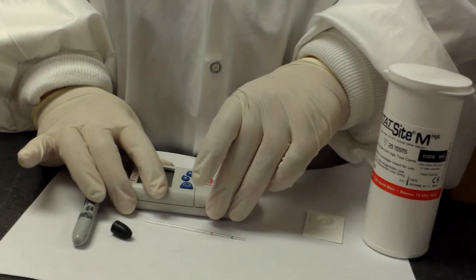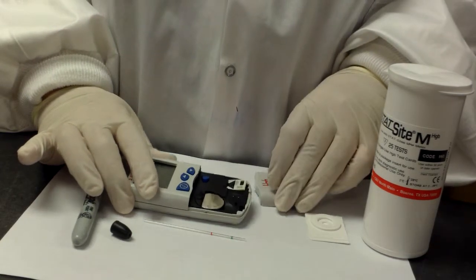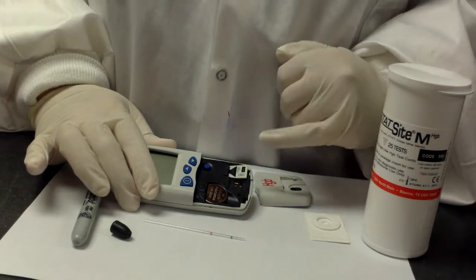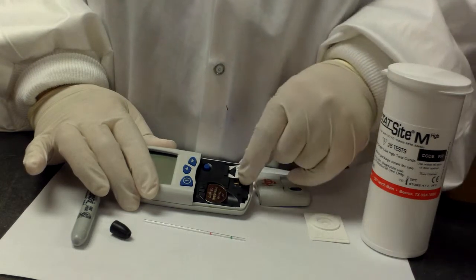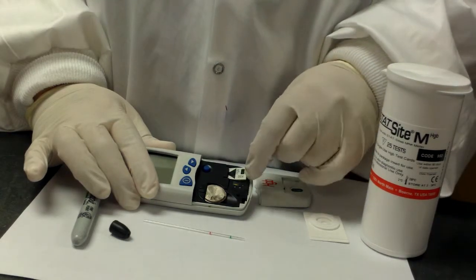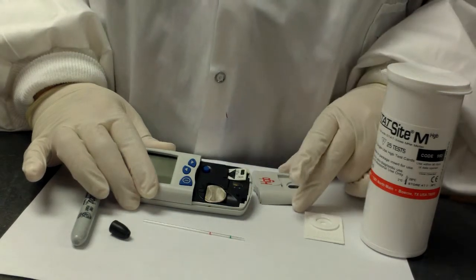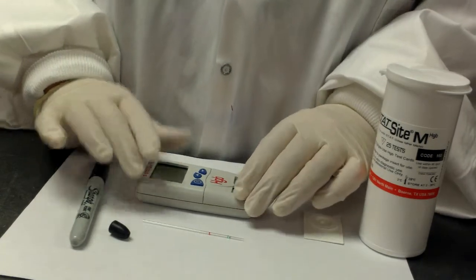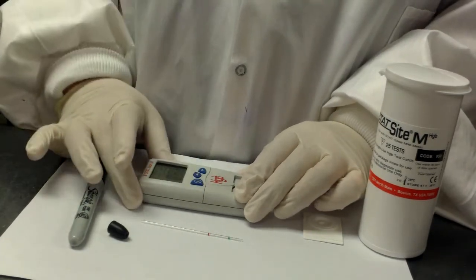So what you're going to do, if it's not, is open this up, and here's the battery. You can change that if it goes bad, or this is just a little chip that comes in the can. You just slide that in or slide it out, sort of like the SIM card in a phone. We've got it put back together. We're going to turn it on.